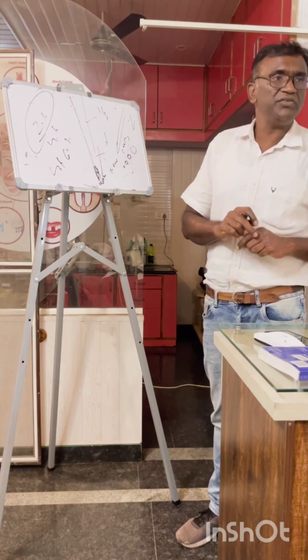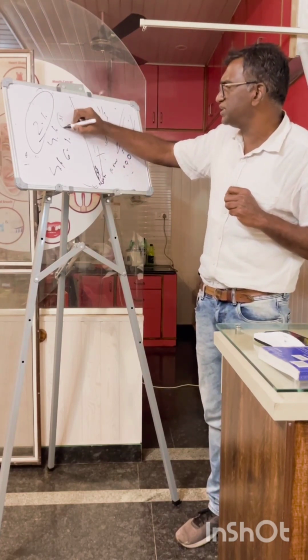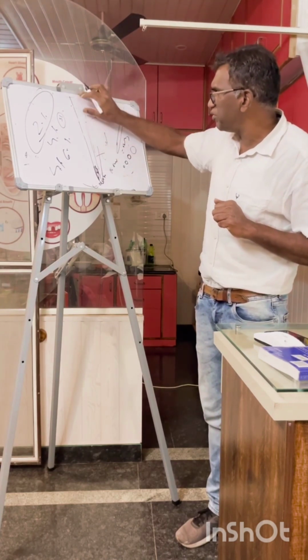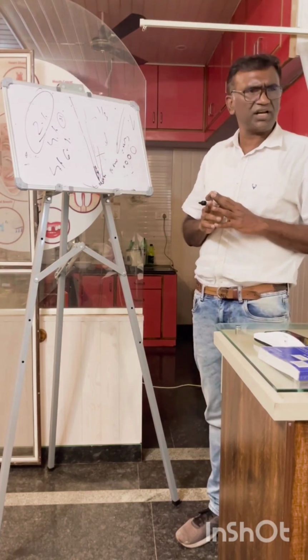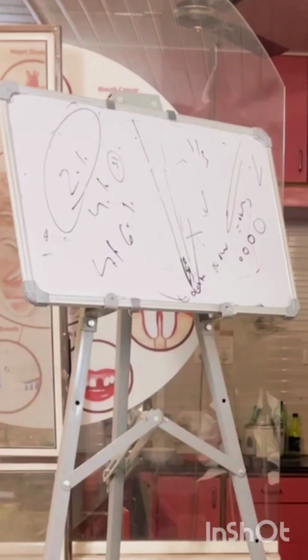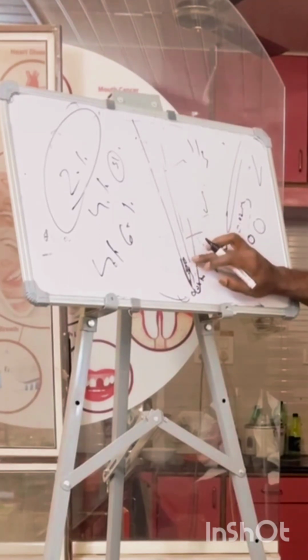If you don't widen it, how will you take your 31 gauge needle? If you have to go till the apex, you have to widen it. In which case? Necrotic cases, severe apical infection, re-root canal cases, where there are chances of biofilms.